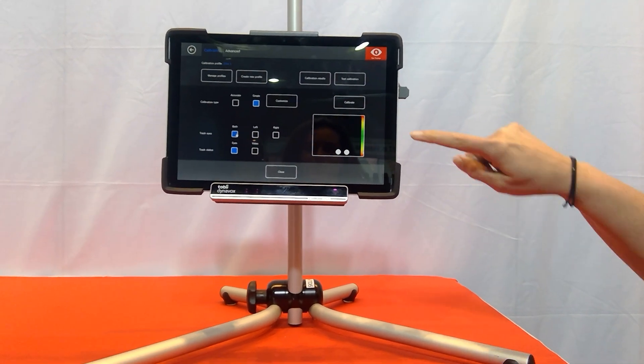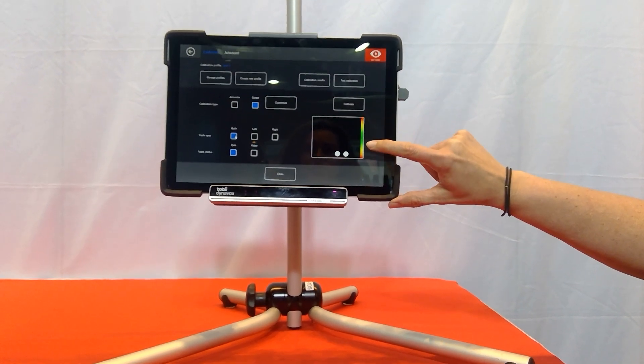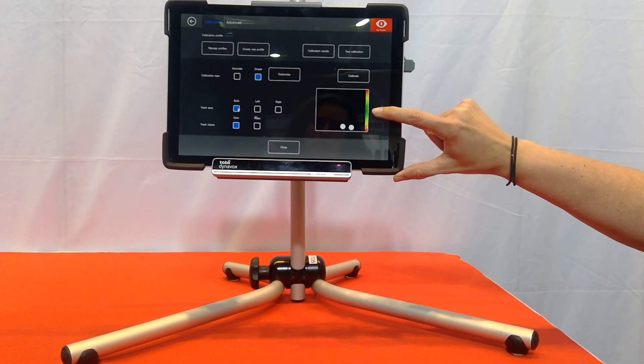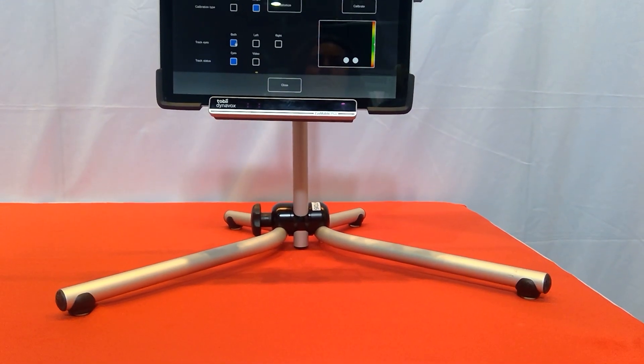Our eye gaze user, as you can see, is not quite in the right position. We have our eyes down the bottom of the track box and we also don't have any arrow in our indicator panel showing us that the person is in the right distance between the eye tracker and where their head is.